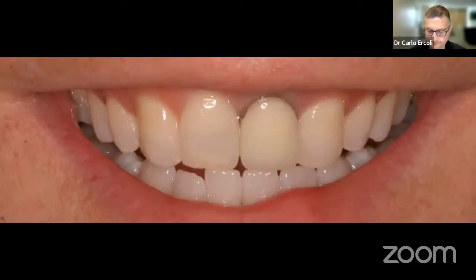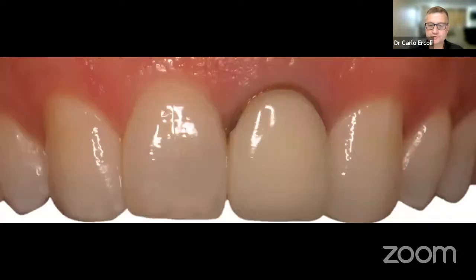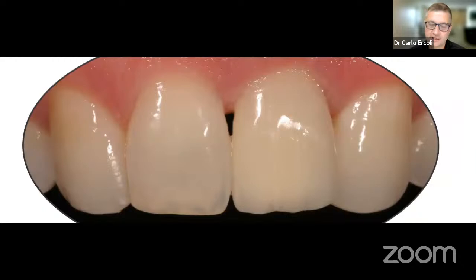And let me show you this case. This is a case of mine from about 15 years ago. That patient was going to lose tooth 2-1, and the tooth was replaced with a metal ceramic crown, as you can see here. Now you notice there is a lack of papilla in that area, although everything else seems to be in good shape. As the patient had that crown, of course, he noticed immediately that soft tissue, and he asked me what I was going to do with it. Well, I said, listen, don't worry about it, because if you leave it there long enough, generally about 6 months to a year, there is often the ability of the soft tissue to grow down a little bit and fill that area.